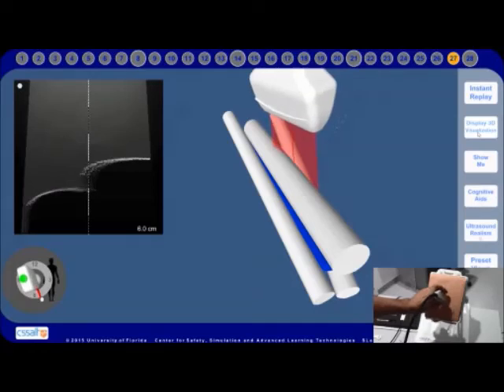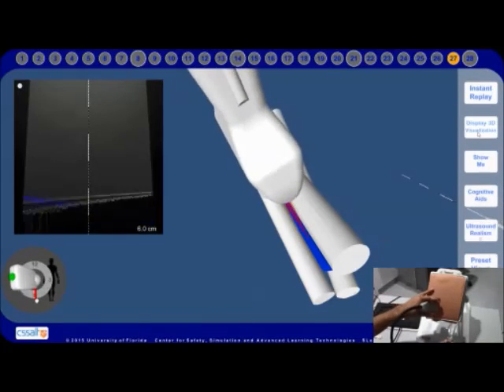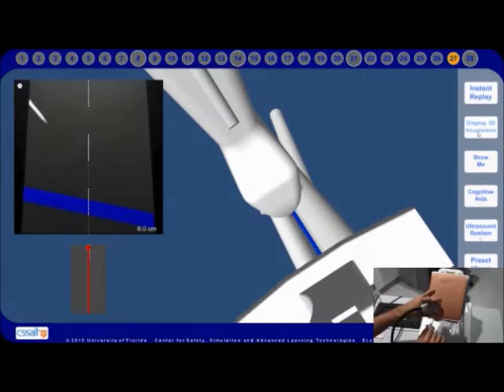Physical objects in the gel may be used as bones to provide obstacles for the user. In the most difficult cases, bones cast shadows in ultrasound and make approaches to virtual vessels challenging.